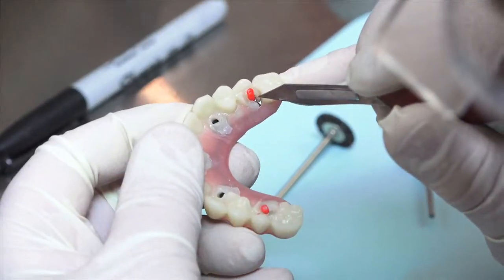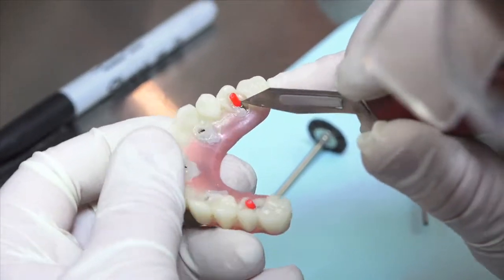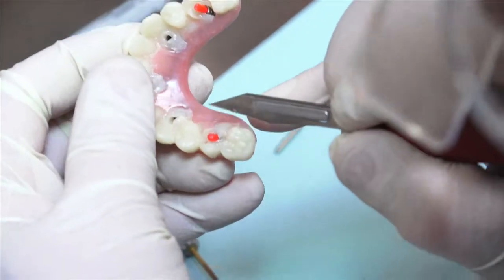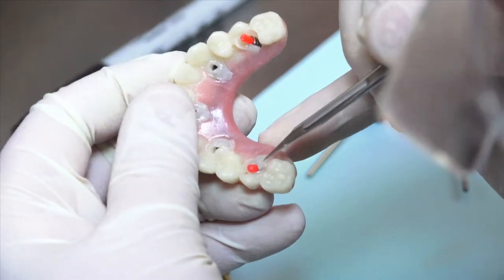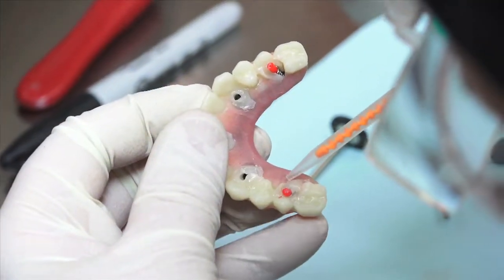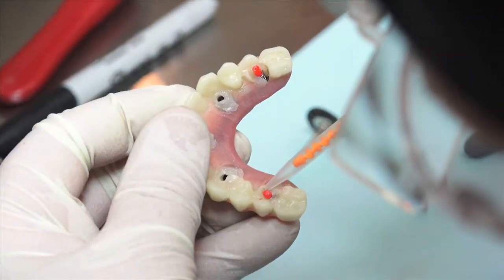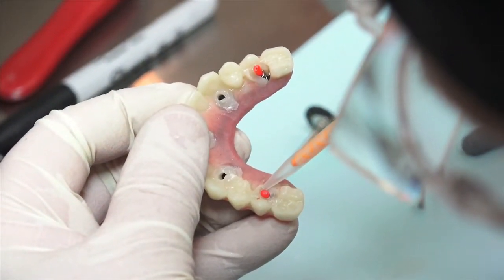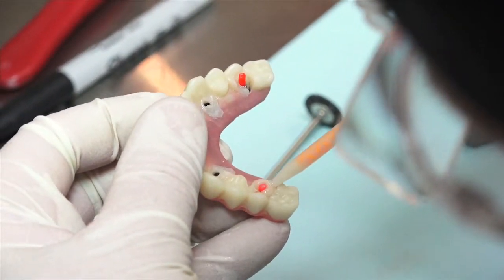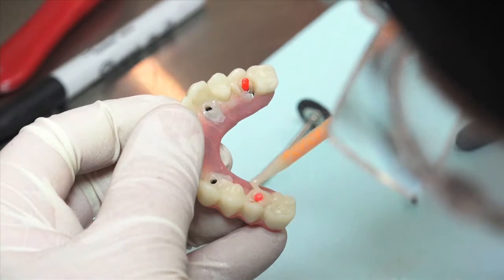From an occlusal view, evaluate the provisional for any voids that may need to be filled in and or any areas that need additional material added to in order to improve the contour of a tooth or teeth. Syringe material into these areas and smooth and shape as needed. To prevent unwanted material from flowing into the temporary cylinders, place any length plastic blockout plug, making sure it protrudes above the area you are adding material to.